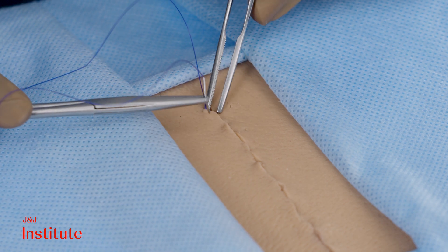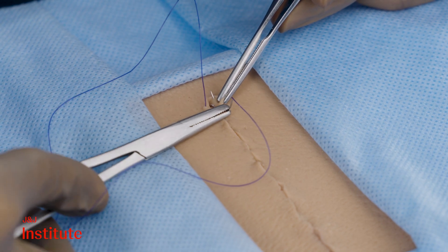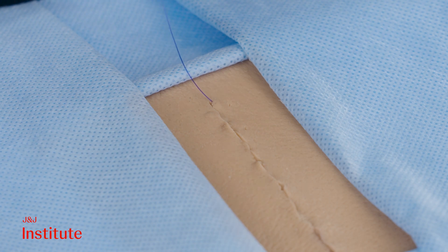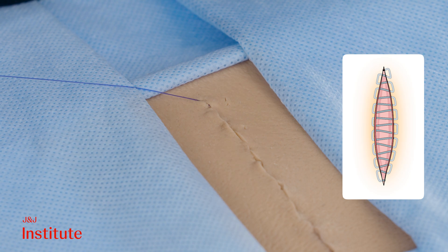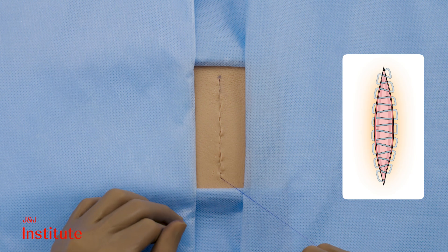The closure progresses continuously and without locking to the other end of the incision. When you spread the skin apart, you should not be seeing any major gaps. A ladder-like pattern should be visible upon spreading the edges, indicating well-aligned wound edges.